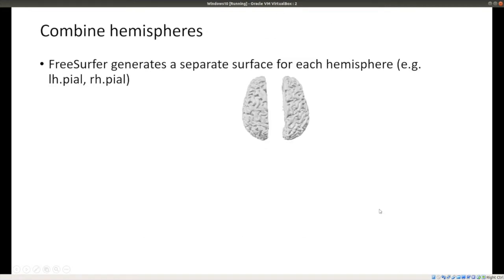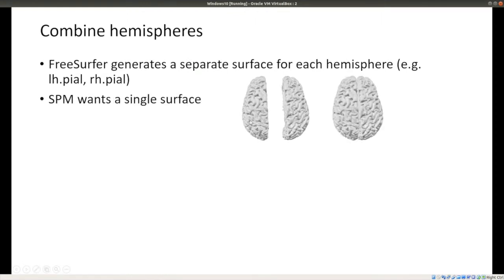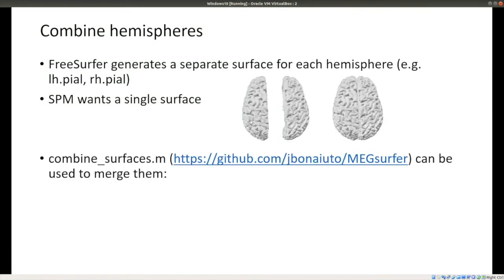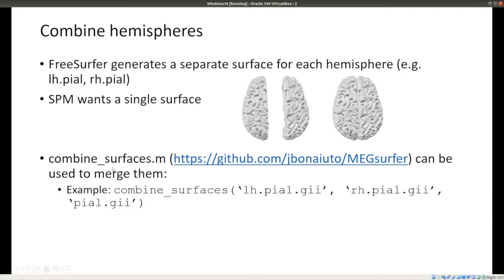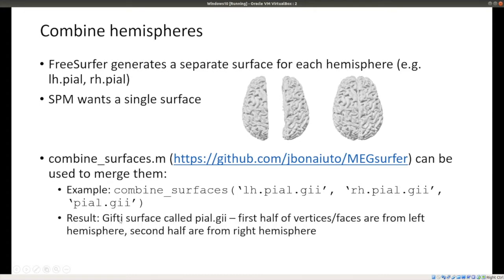FreeSurfer generates a separate surface for each hemisphere, but SPM wants a single surface. Using the 'combine_surfaces' function in MegSurfer, you pass two surface names and the combined output name, creating a GIFTI surface where the first half of vertices and faces come from the left hemisphere and the second half from the right.